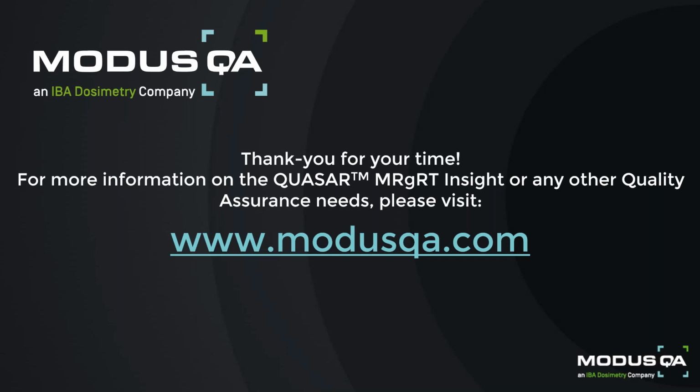But if you've seen something wrong with your system's distortion, you would likely need something a little more robust to further evaluate that in 3D. That is where your MRID 3D will come in. So basically, the Insight is a tool that can be used to trigger investigations and interventionist actions and services if you find that your GD is out of tolerance. Afterwards, you can use your MRID 3D for the actual investigative process. I hope that helps answer it.